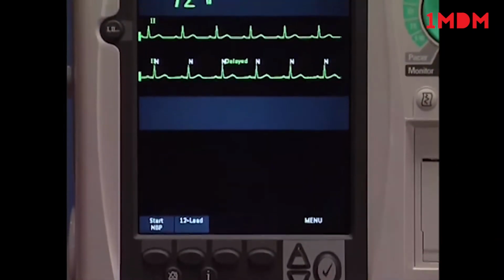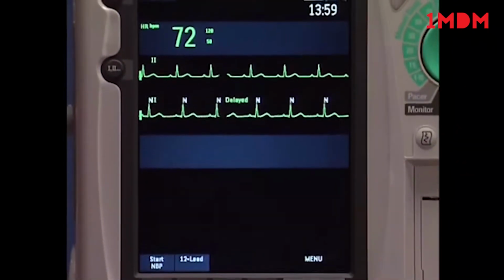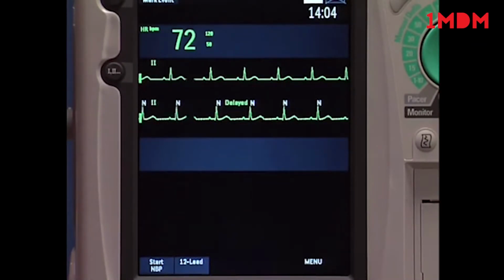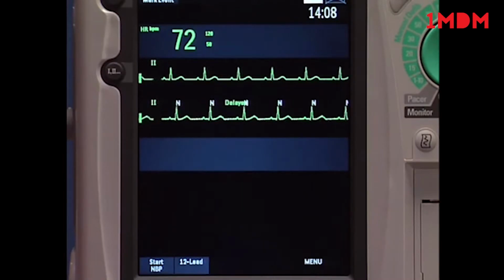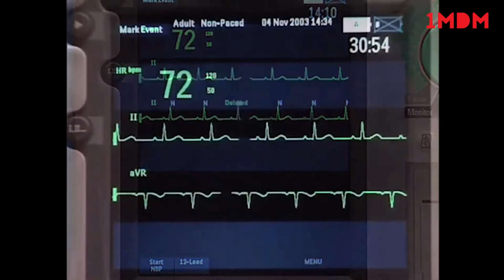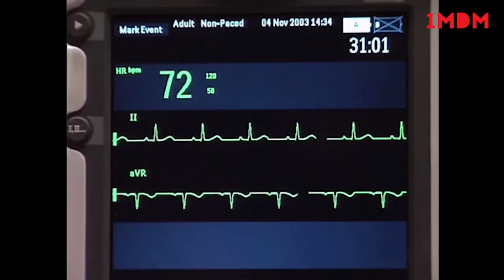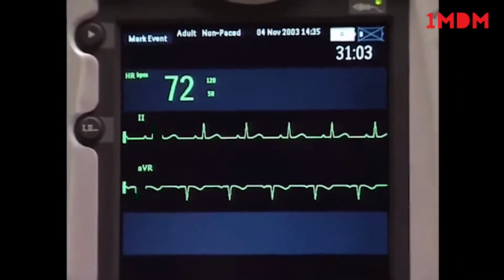The MRx uses the STAR basic arrhythmia algorithm for monitoring arrhythmia. It monitors pediatric and adult patients' ECGs for heart rate and ventricular arrhythmias and generates alarms. It specifically uses the ECG lead appearing in wave sector 1 for single-lead arrhythmia analysis. Note that increasing the wave size does not affect arrhythmia analysis.